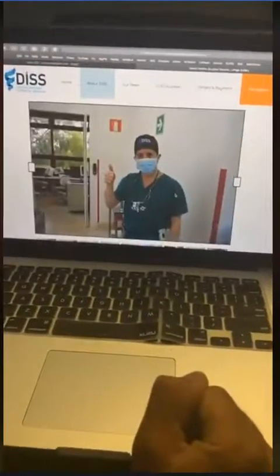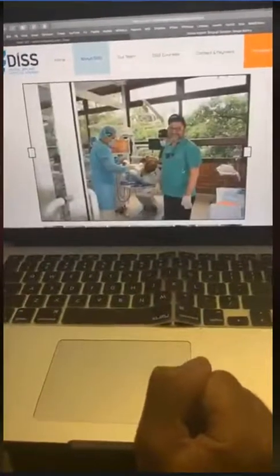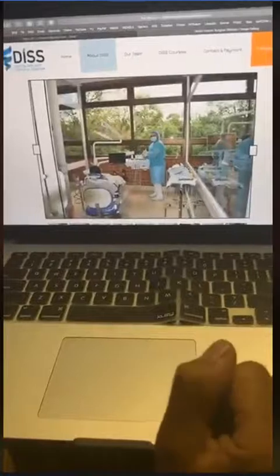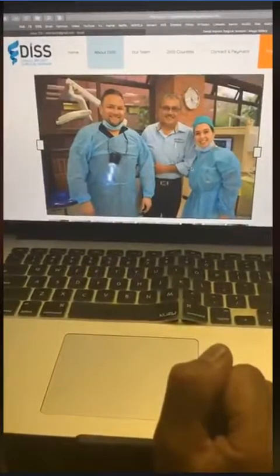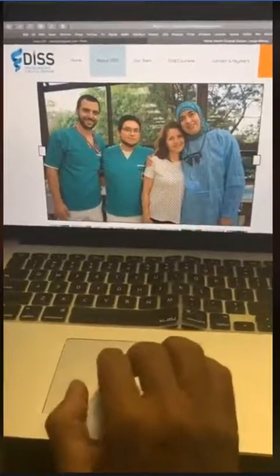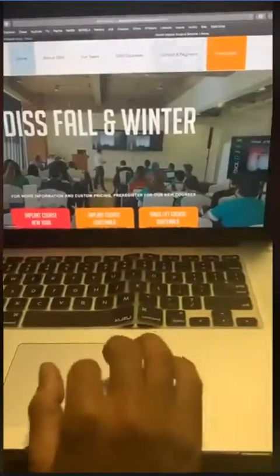The New Parts Dental Lab will make those guides for you, and you can pick them up from them, and you can have those surgeries. And I would definitely tell you that if you do not have a CBCT, you could send it to them directly, and they will also do your STL files.